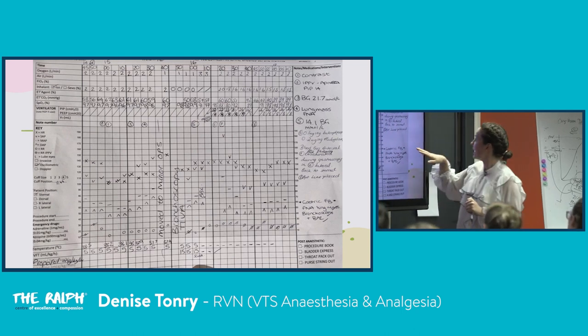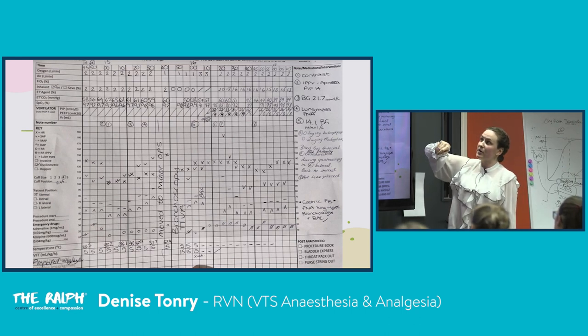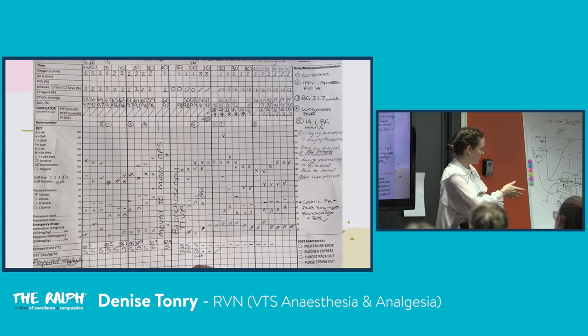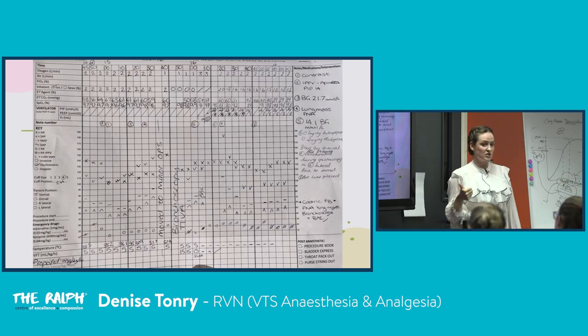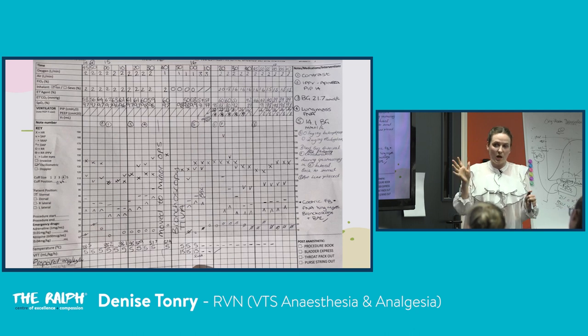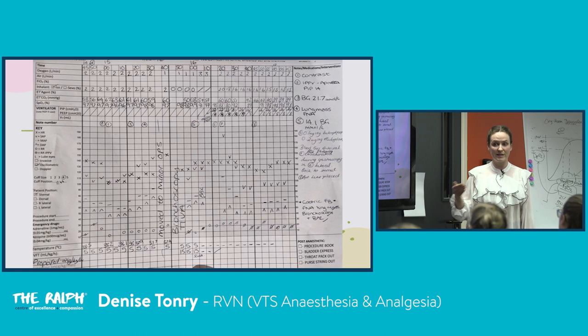In this case, we drew an arterial blood gas to check if it was accurate, and the PaO2 was 84, which is extremely abnormal. Again, what have we done? We've come down here. Even with 100% oxygen and ventilation, albeit manual, and we're just starting mechanical ventilation, we're not managing to correct this hypoxemia. So this is a true hypoxemia.